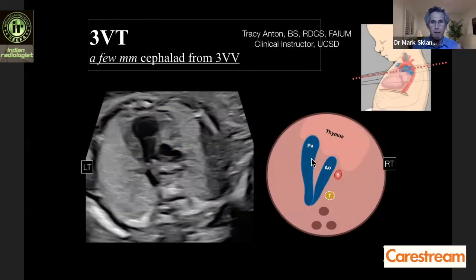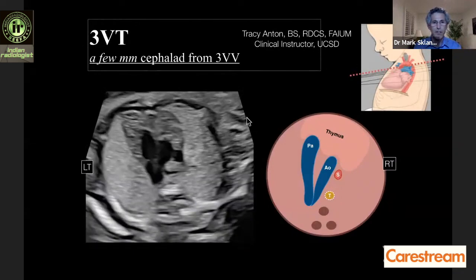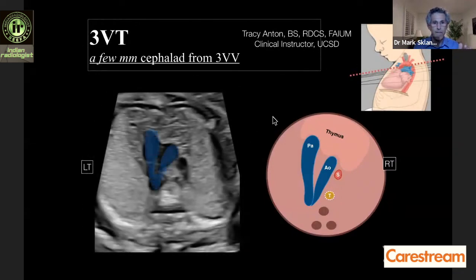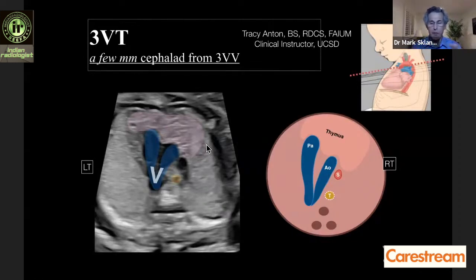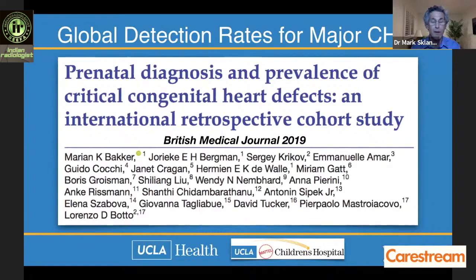The three vessel tracheal view shows the V sign, confirming a left aortic arch and providing much more information. Moving the image you can see the V formed, the trachea, and the thymus anteriorly. There is also a nice tutorial paper on the three vessel view published by AIUM in the Journal of Ultrasound in Medicine that is worth reviewing.